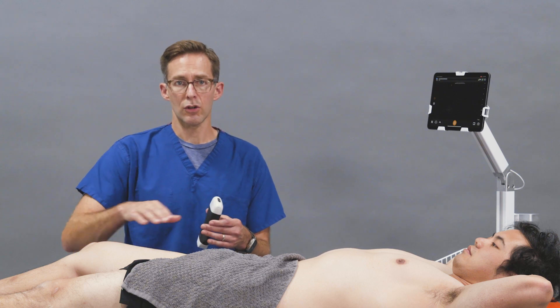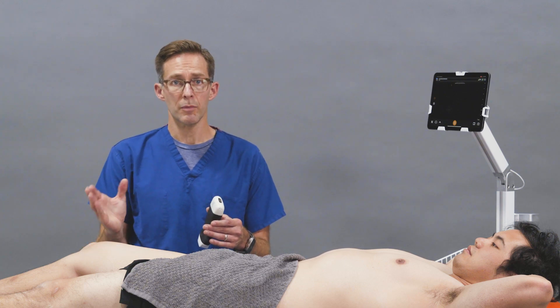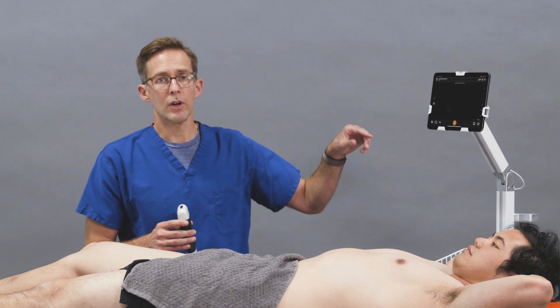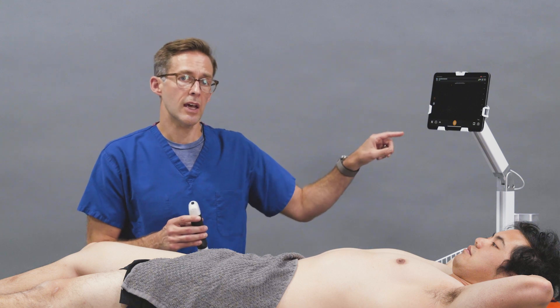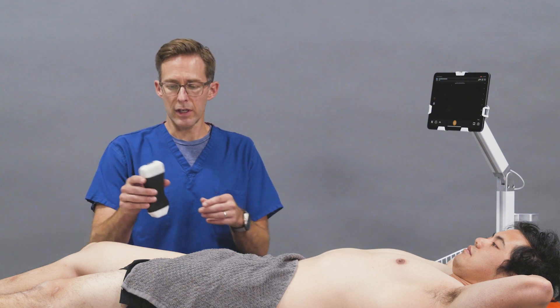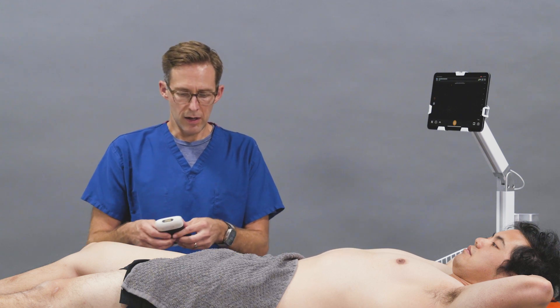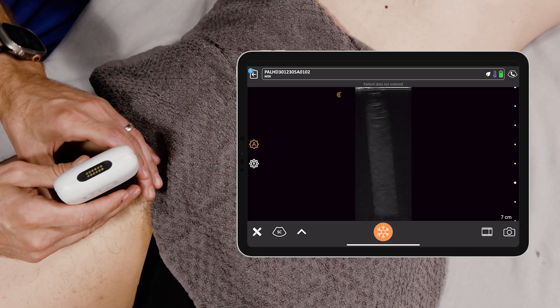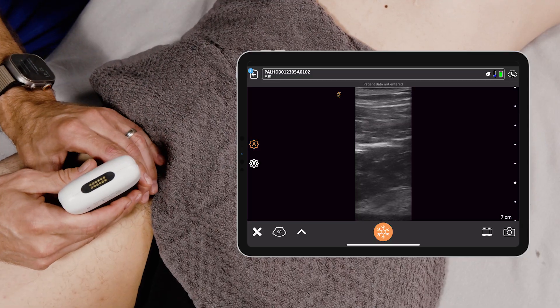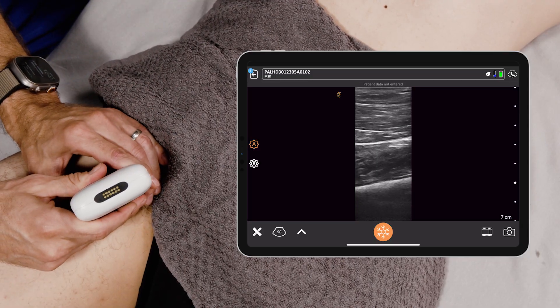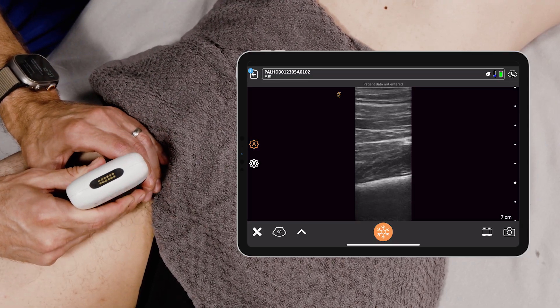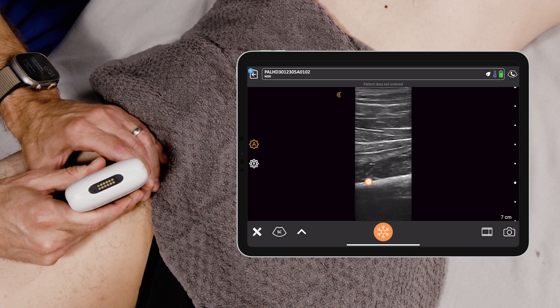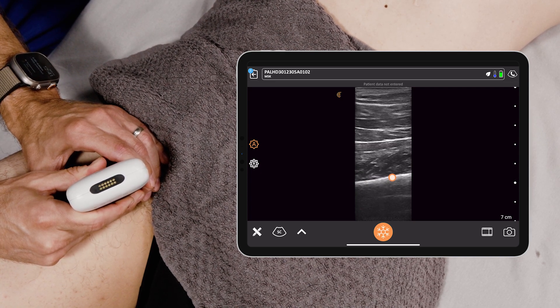They can kind of externally rotate the hip if possible. In your preset you want to do the MSK setting. In longitudinal orientation you really want to identify the femur, kind of the mid-femur. That hyperechoic structure at the bottom of your image is the femur.